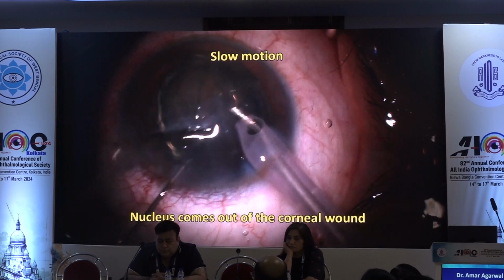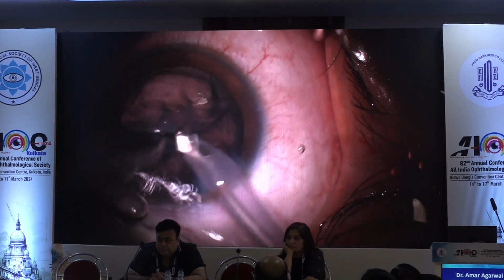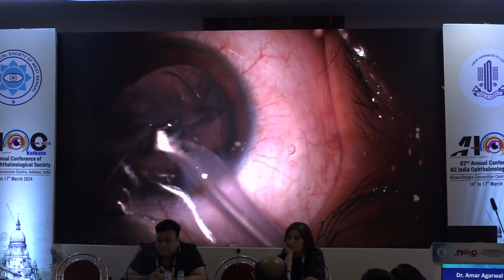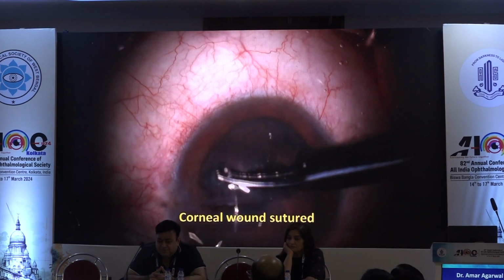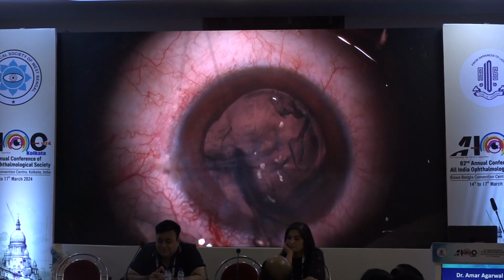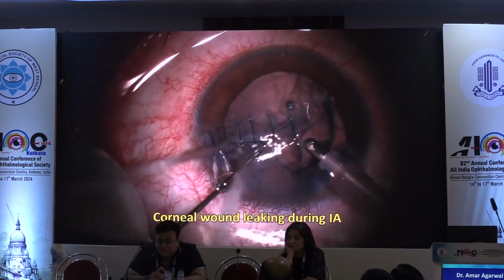You know what happened? It came out of the wound. My wound opened up. Oh, my heart sank. Pop. Okay, I said, patient has come all the way, referred to me from Bangladesh. Man, I thought, make this patient all right. So I said, okay, now nucleus has come out faster than I can imagine. Let me suture it up.